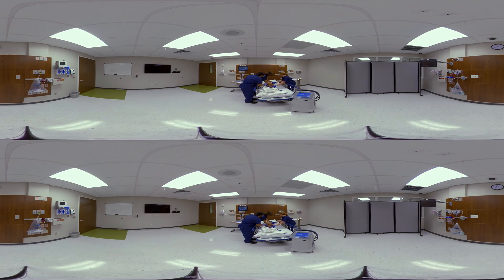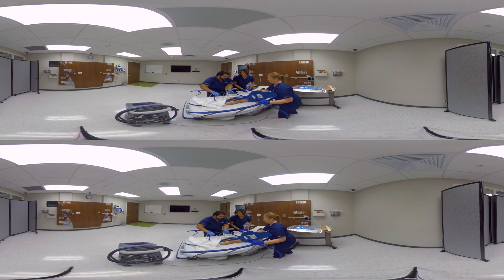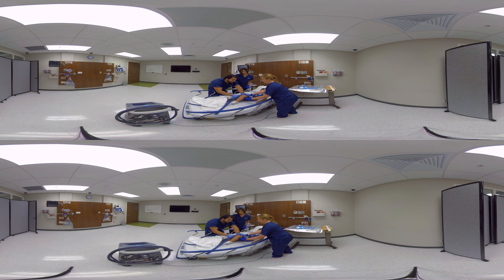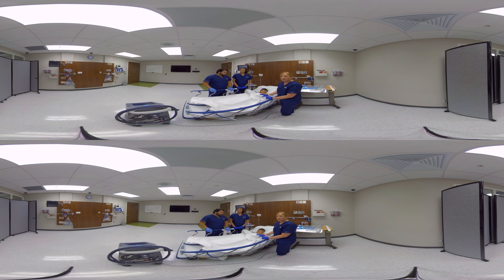Now we're going to roll him to the other side. To place the torso pad, we're going to line the long straight edge up next to the patient's spine, allowing for a couple finger width distance between the two pads. We can then wrap it around the torso and roll the patient supine. To place the thigh pad, we'll simply bend the knee, line up the hoses anterior to the patient pointing towards the patient's feet, and wrap it around underneath. Ensure the pads are not too tight to allow for full respiratory excursion, and check the skin according to your hospital protocol for areas of chafing and readjust the pads accordingly. The pads are meant to be readjusted for up to five days on each patient.